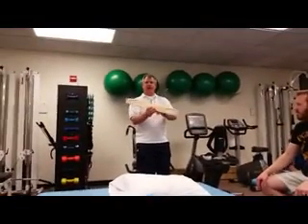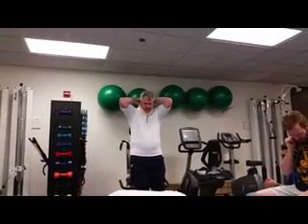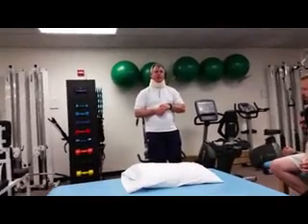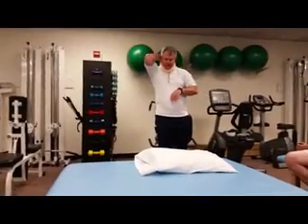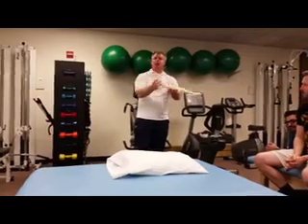This little zip here is for the chin. So if I put it on myself, it just goes on like this. It doesn't give much support. It's more saying, oh, I need to try to stay in mid, keeping my head in neutral.